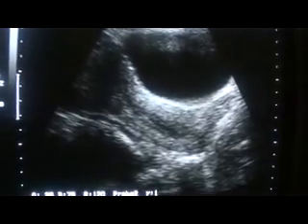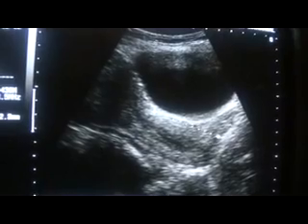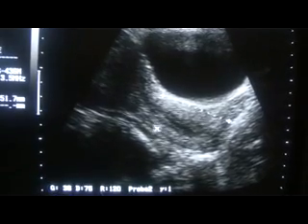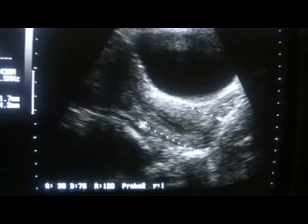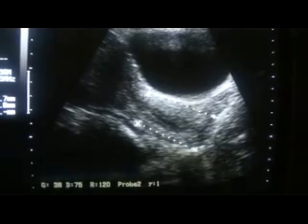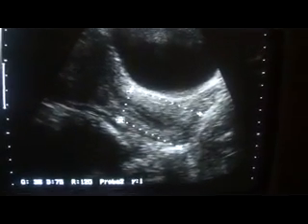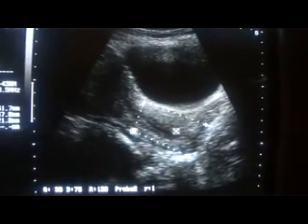In transverse section, we are seeing multiple focal lesions lined up in the posterior wall of the uterus. In this view, more prominent are these two. This is the transverse section of the uterus.